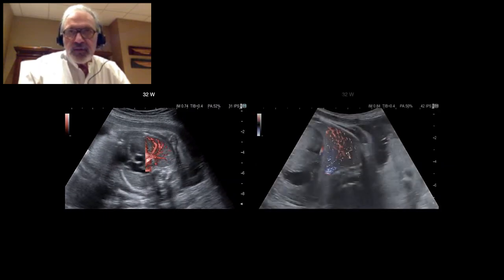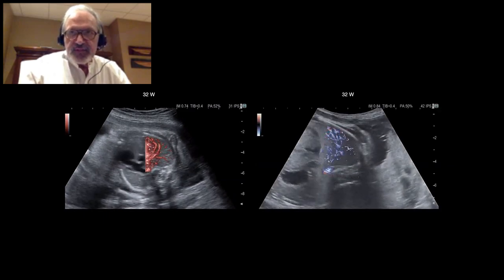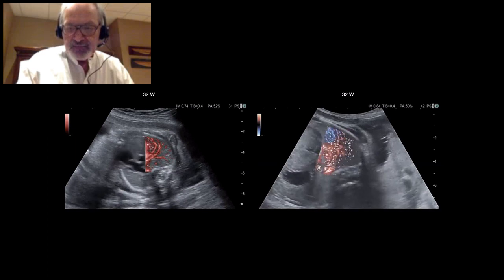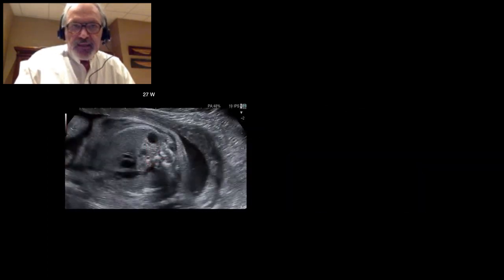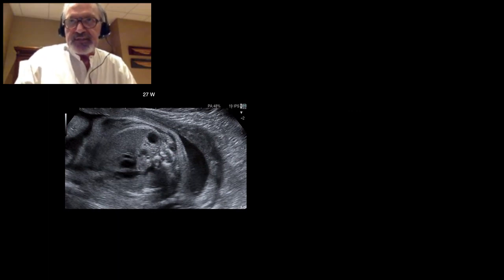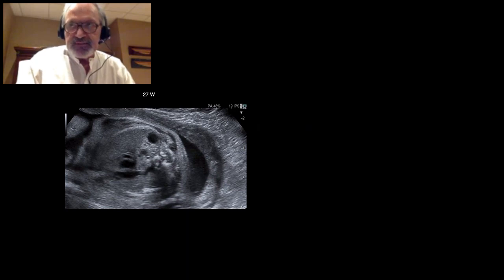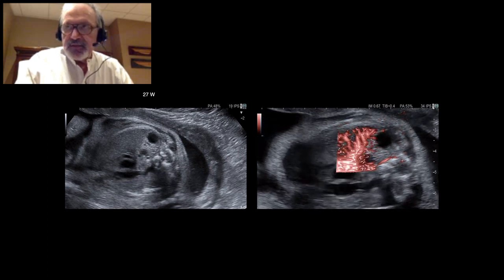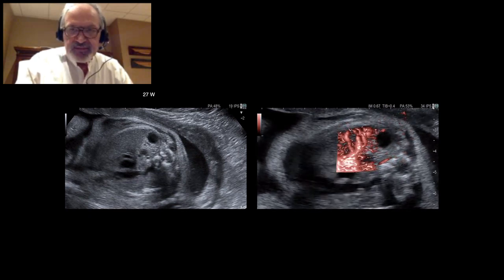Also in the third trimester, depending on the setting, we can highlight the larger trunks or the small distal vessels, even when the fetus is making breathing movements, as you can see on the right. In this situation, where there is a pulmonary malformation associating cysts and hyperechoic parenchyma, the DFI system shows poor vascularization in the abnormal territory, which is compatible with CPAM.